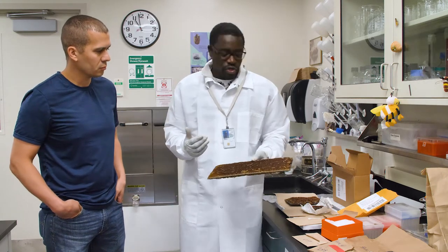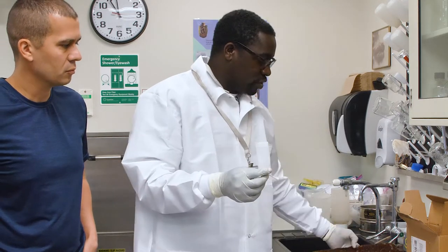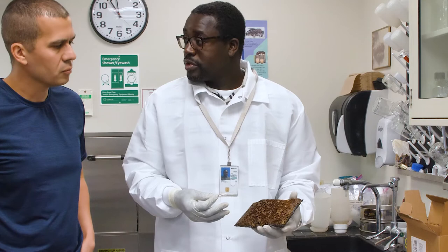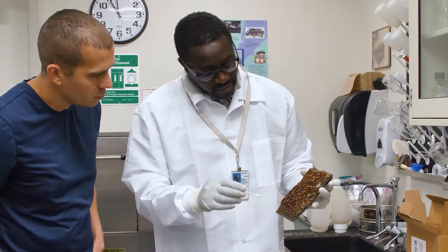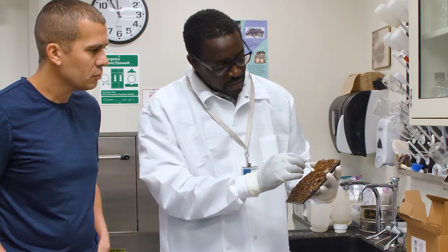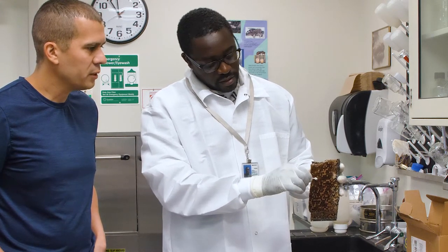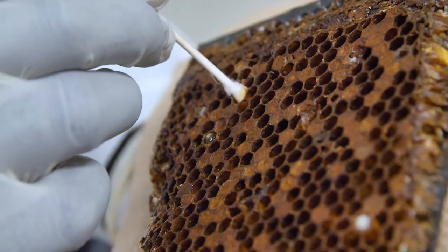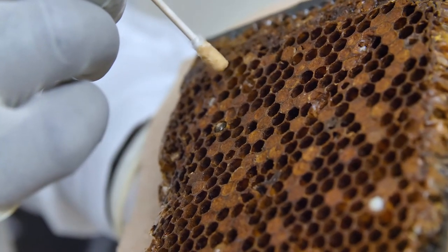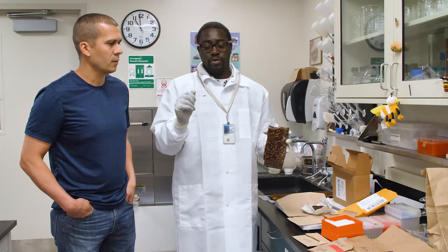How do you do that? Basically what you want to do is get a Q-tip swab. Look at a cell that you think has diseased brood, and in any case what you want to do is just take the swab and carefully select the cell and swab in — clean it up, get all the tissues, all the brood, the liquids, everything that's in the cell. This is what we call a smear sample.